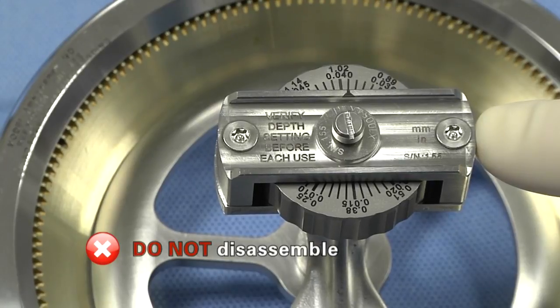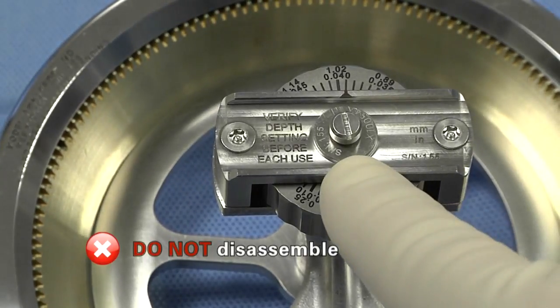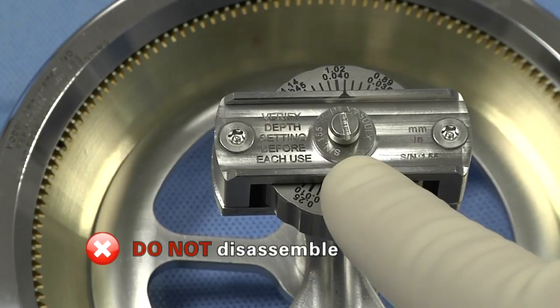Do not disassemble the depth gauge assembly at any time. If done so, factory recalibration would be required.